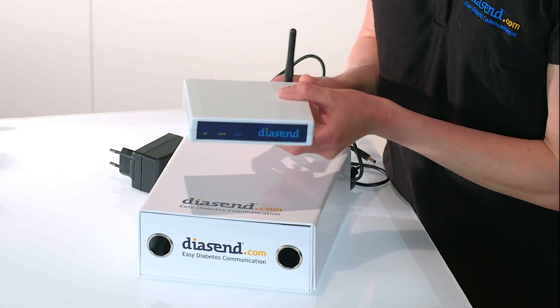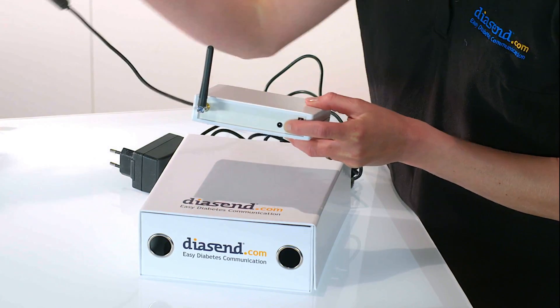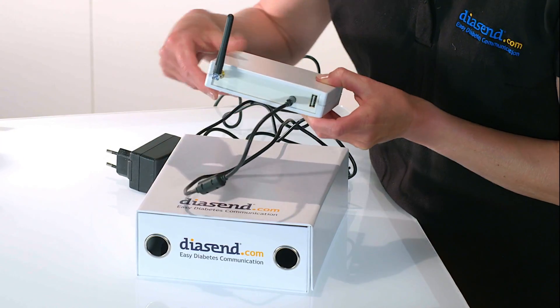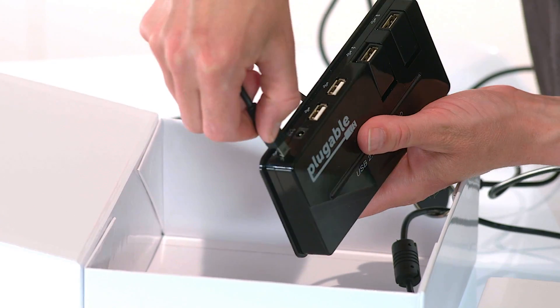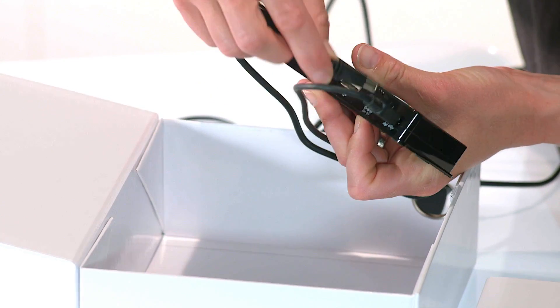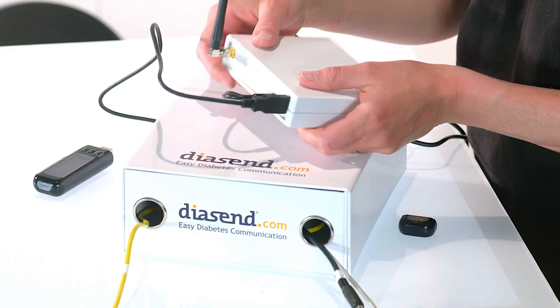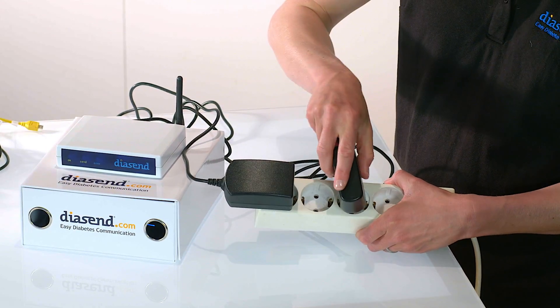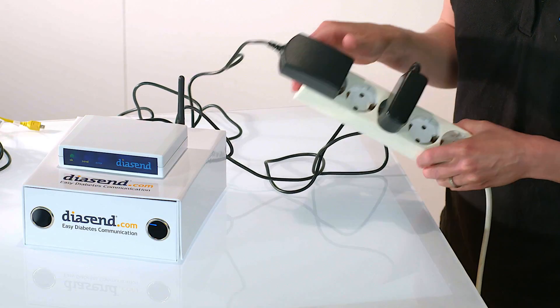To set up your transmitter you need to plug it into a power source. This is the back of the transmitter. You will need to connect the round one pin plug that should be connected to the back of the transmitter. You also need to connect the USB hub and then connect it to the back of the transmitter like this. Once you've done that you need to plug in the power supply at the other end into a power socket, one for the transmitter and one to power the USB hub.